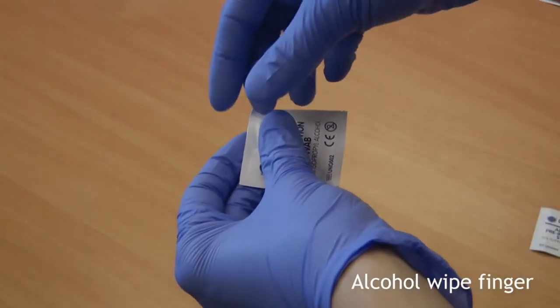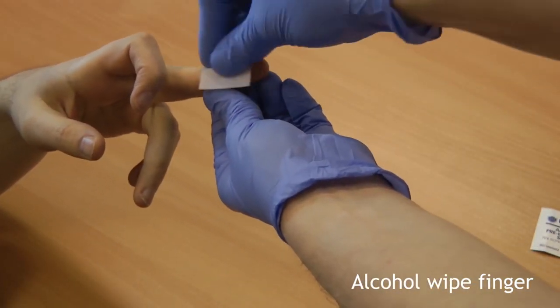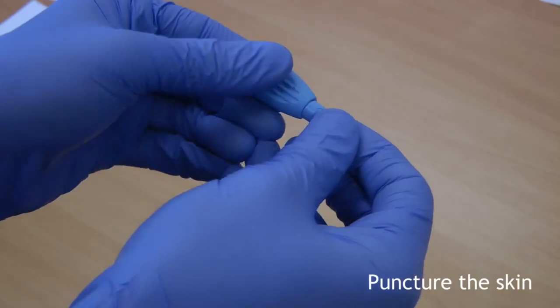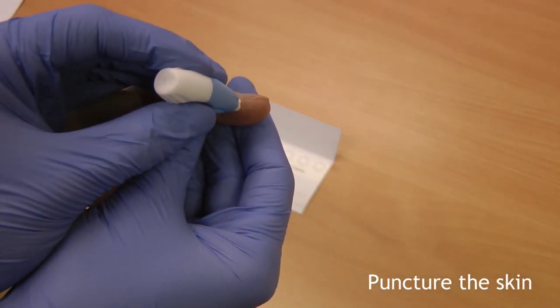Next, take the alcohol sachet and clean one of the middle, ring or little fingers. Please avoid the finger pad and nail bed. Holding the lancet between your index finger and thumb, place the tip of the lancet on the finger you have cleaned with the alcohol wipe.